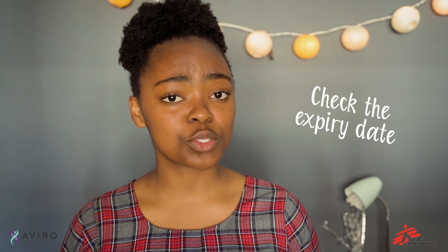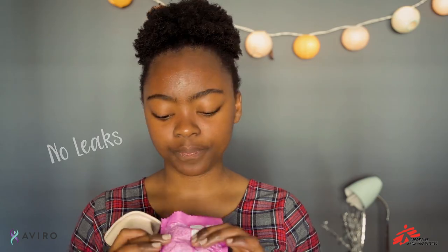First things first, check the expiry date — you want to know it's going to work. Next, make sure the packaging has no leaks and just squish the lube around a bit. Then carefully open the packaging, making sure not to damage the condom.